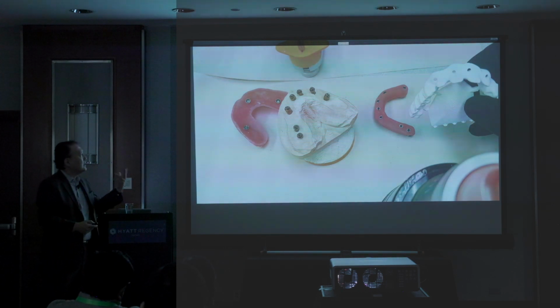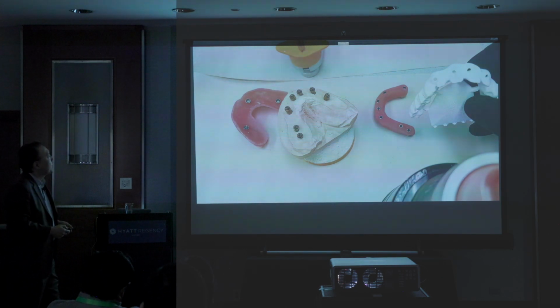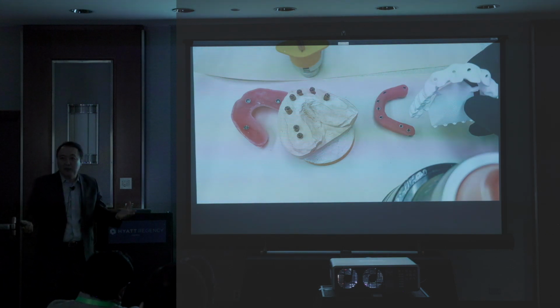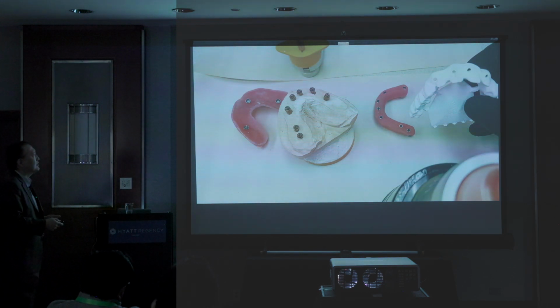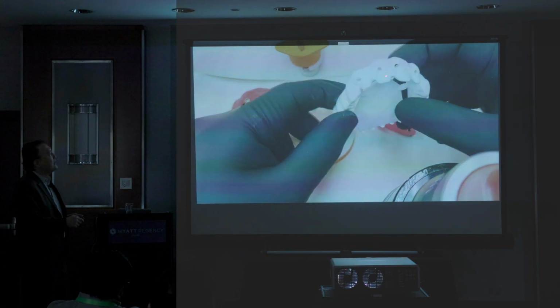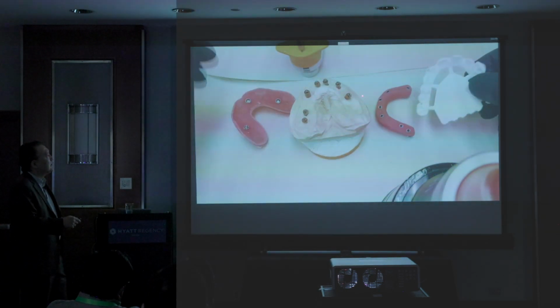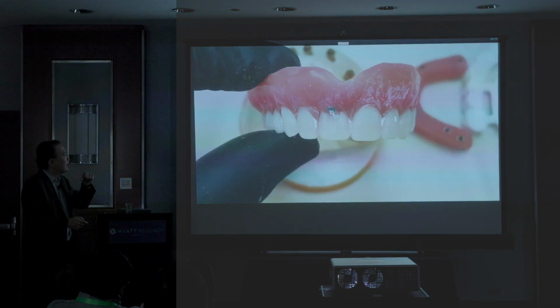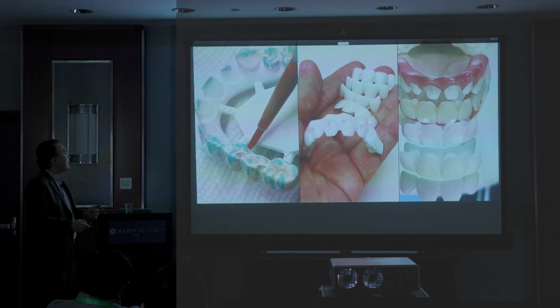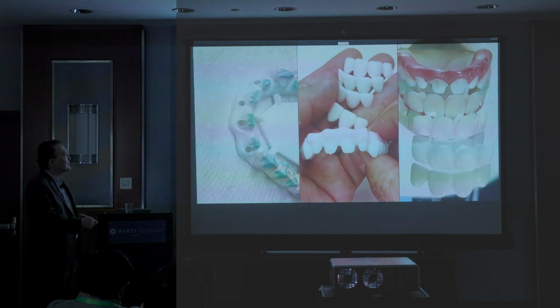Now there's another weird case. Like I said, all implants are facially out. So multi-unit abutments, you cannot use them. What are you going to do? That's my job. I'm trying to help the dentist as much as possible. So we designed it with an open anterior, and then here's the screw retained. And on top of that, I'm going to put another set of crowns too. Okay, so this is the try-in, and then I put the coloring, and then here's all the opacity test.